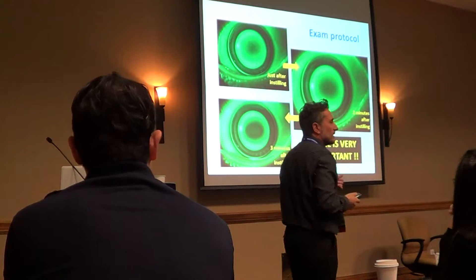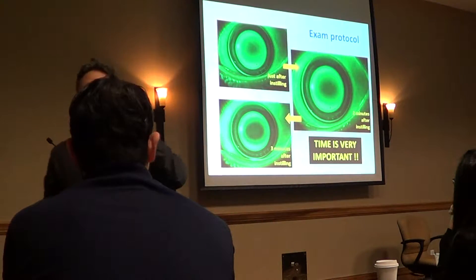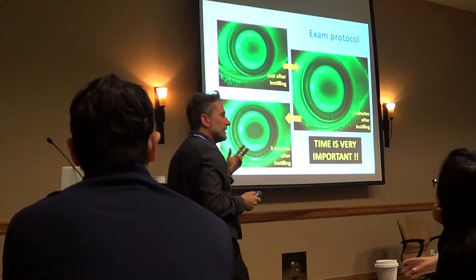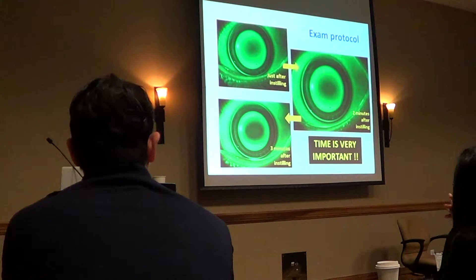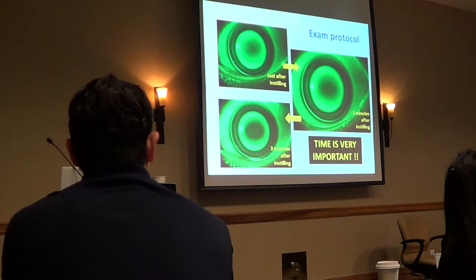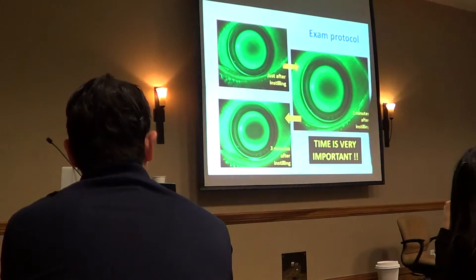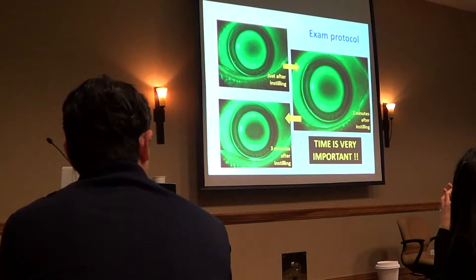Here we can see the three-minute steps pictures. The first picture is just after you put the fluorescein on the eye — one minute after. The second one is two minutes after. The third one is three minutes after. Around three minutes is the ideal time to see the picture. If you go before, you have fluorescein on the front area of the lens and the lens has not settled. If you go later — after four or five minutes — the fluorescein is gone. So you have a window to look at the perfect fluorescein pattern.